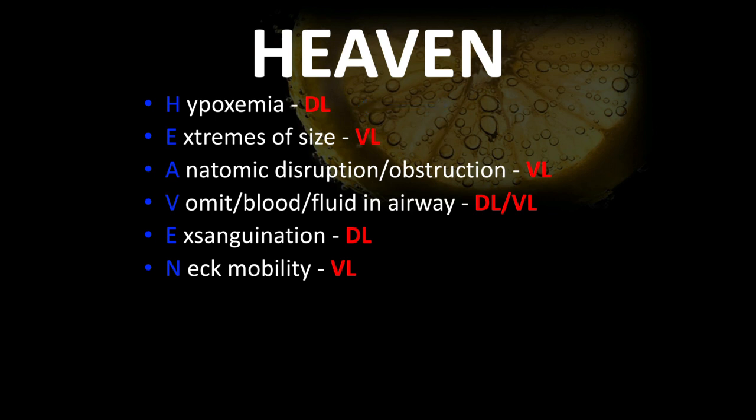We've learned it's better to slow down, evaluate your patient, and oxygenate your patient using passive oxygenation techniques first: nasal cannula maxed out, non-rebreather maxed out, have a BVM ready and waiting, have a PEEP valve applied, but we don't just automatically start bagging our patients. We want to use passive oxygenation, but we want to make sure our first pass attempt is going to be in that 93% or greater SpO2 range.